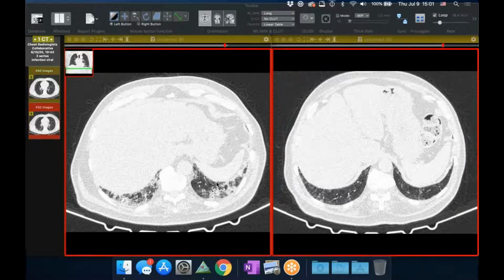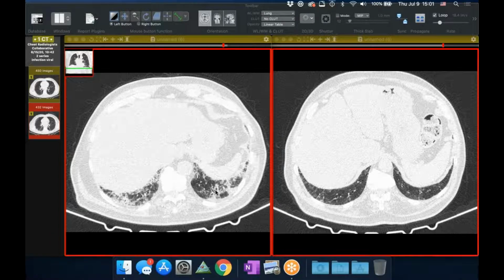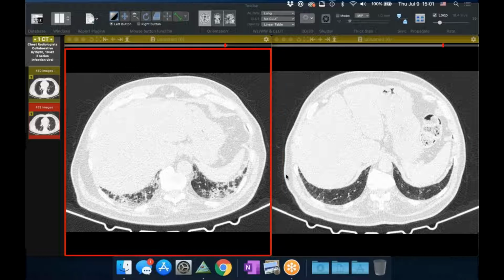So in the setting of an acute lung injury, just not to overcall traction bronchiectasis. I fell into this trap a few times earlier in my career. I'd say it looks like it's fibrosing and it doesn't look good, but indeed you can get better. And so was this patient treated with steroids or anything?